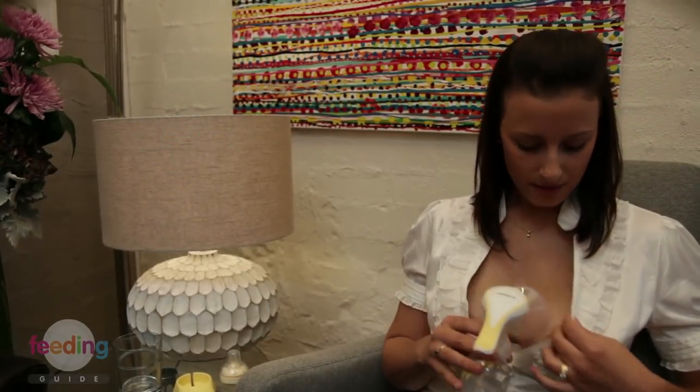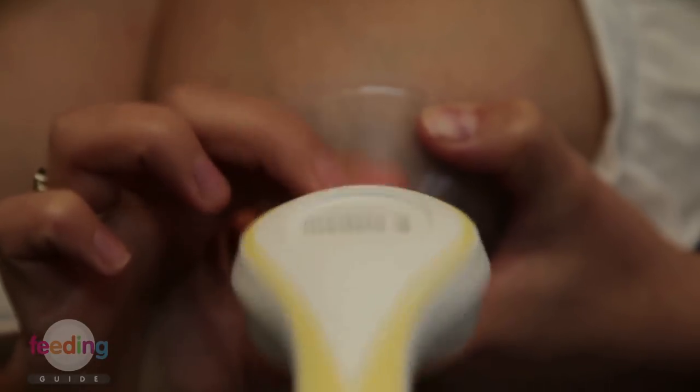Now I'm going to show you how to correctly attach the breast pump. First of all, line the shield up onto the breast with the nipple in the centre of the tunnel. Support the breast and hold the breast pump in place. When you're ready to begin, use quick short pumps to stimulate the letdown.